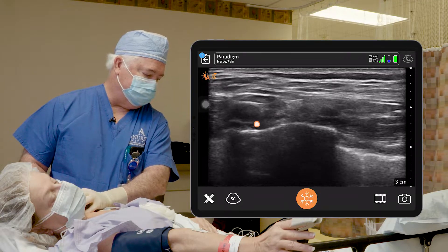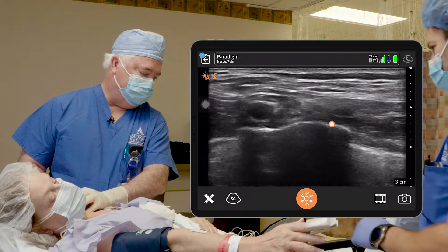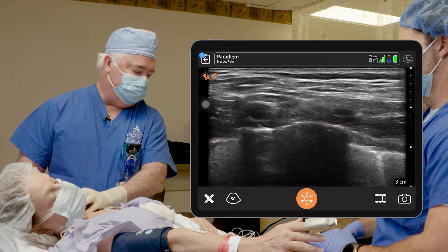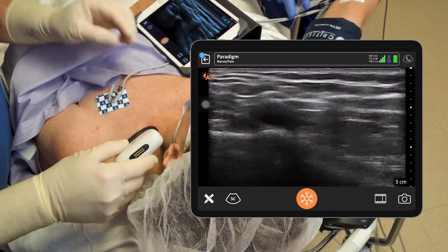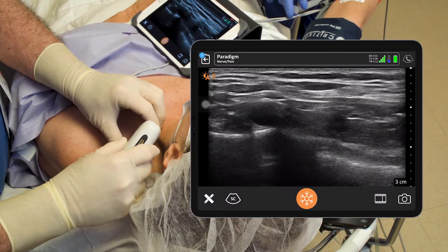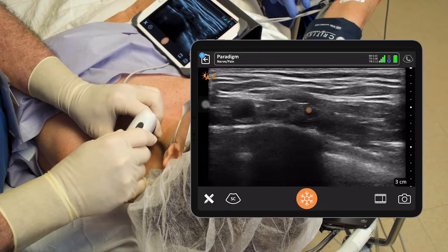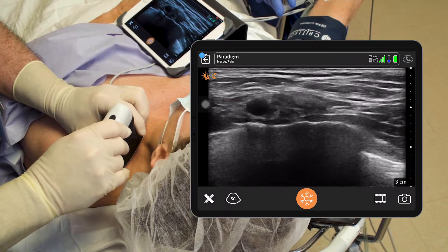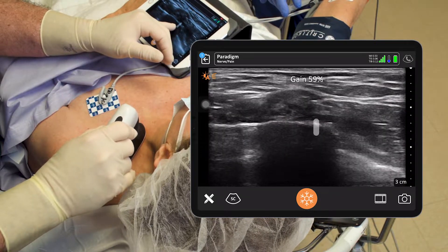Right below it you see a nice first rib. Below the first rib is the white line, and then below it's dark because bone impedes ultrasound penetration — it's going to be dark under bone. Now we're going to take the probe and rotate it a little bit posterior so you can see the nerves sitting right on the first rib, and you can see the lower trunk.